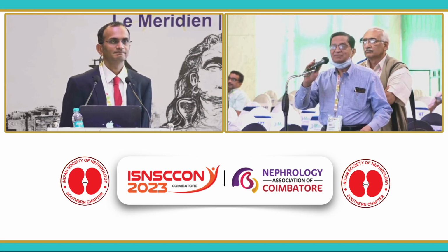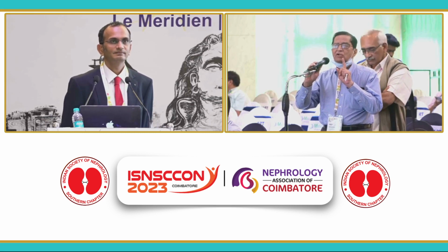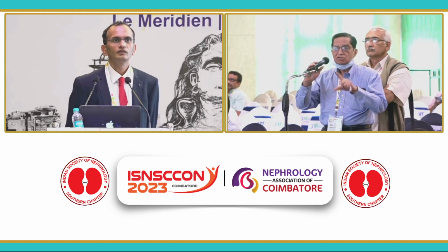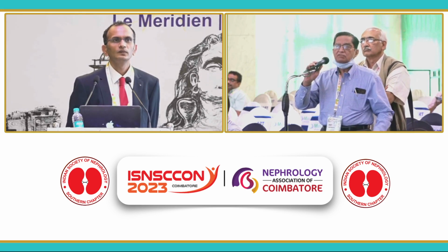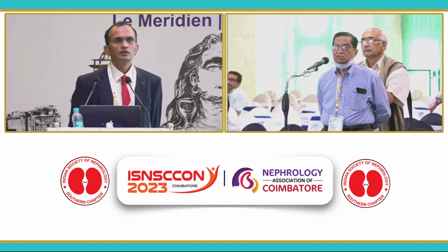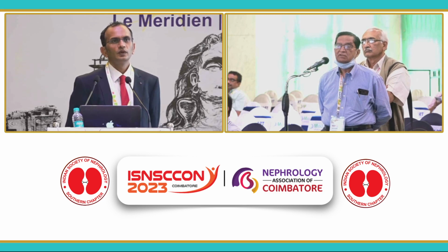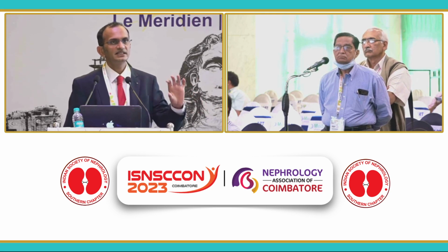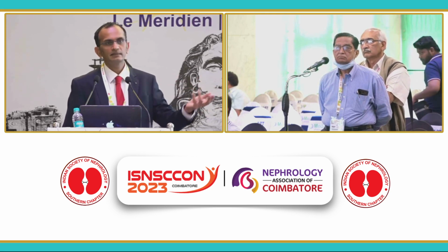First of all, congratulations, bringing in something new in dialysis after almost 5 decades. Most important, did you measure the residual bundle volume after the procedure, as per the standard literature of your dialyzer? Was there any change in the bundle volume at the end of the dialysis? Did you calculate that? We did that by putting the dialyzer on the reprocessing machine, and surprisingly, we didn't find any change in the bundle volume, and it passed the pressure tests.